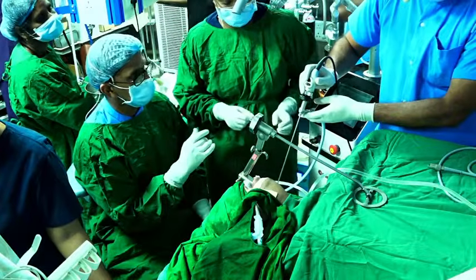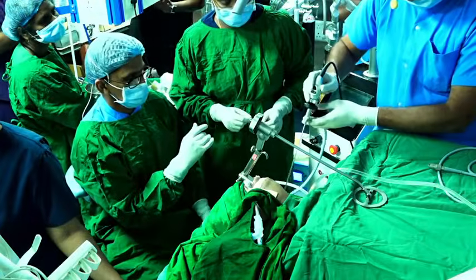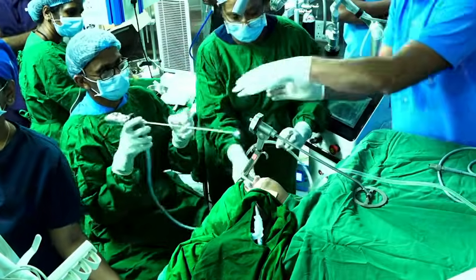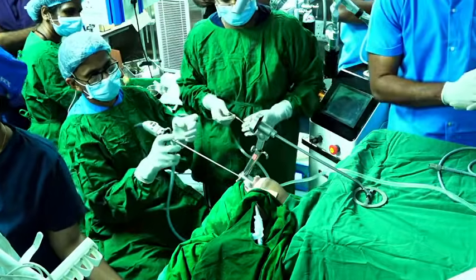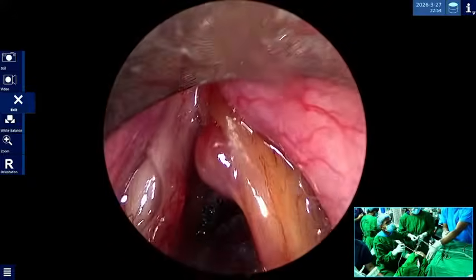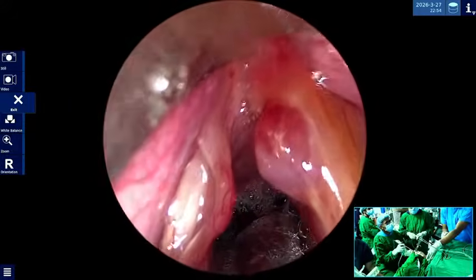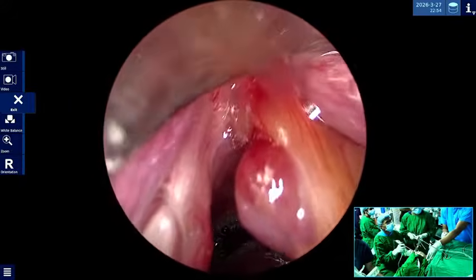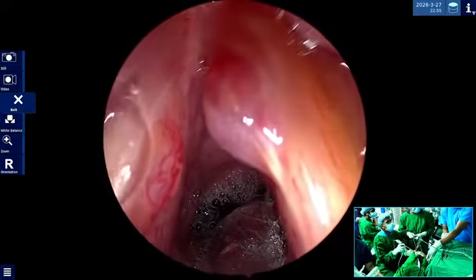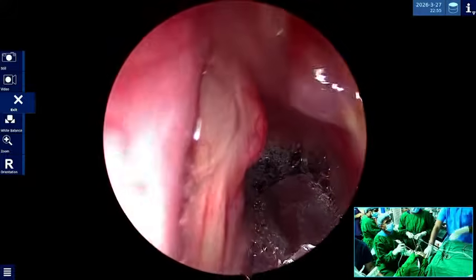So once you introduce the laryngoscope, wide bore laryngoscopes, as Akshay showed this morning, before proceeding with surgery you have to analyze the depth of the lesion completely. As far as malignancy is concerned, you look for any other lesion and how far it has extended.